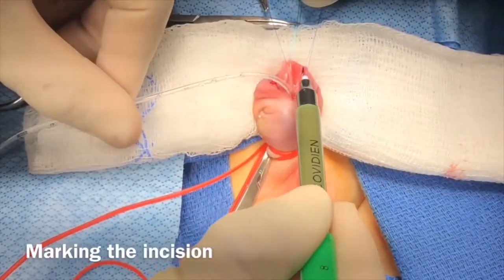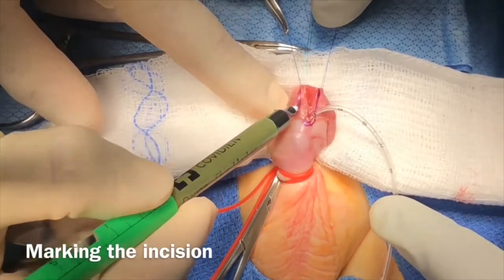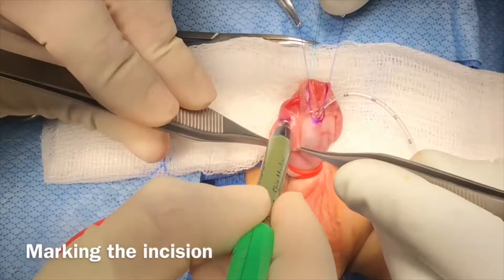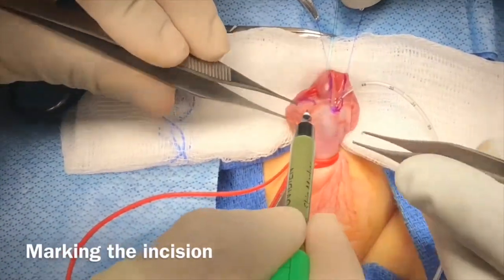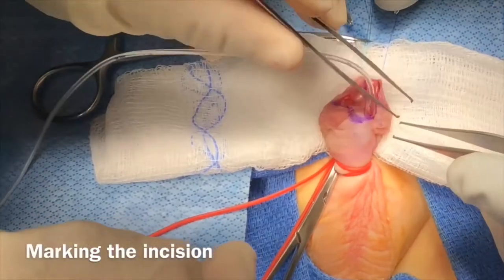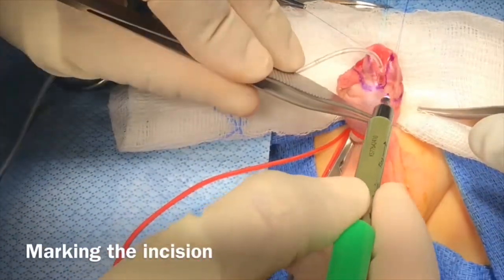Two stay sutures are placed at the future distal neomeatus with a 6-0 PDS suture. A 5-French feeding tube is placed across, and the tourniquet applied. The marking is performed on either side of the urethral plate, including the hypospadiac meatal opening.